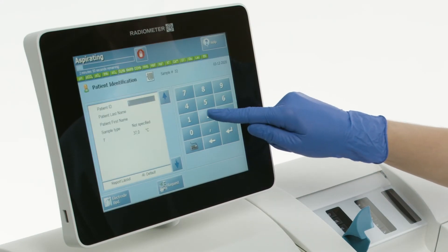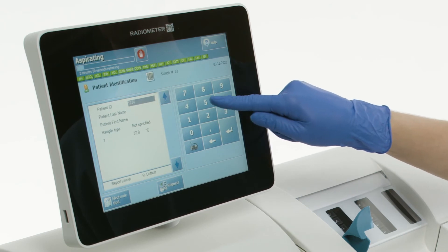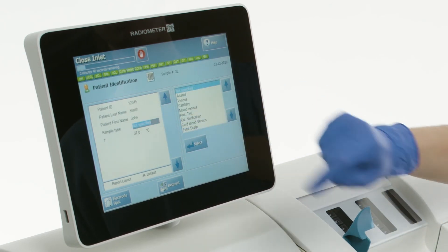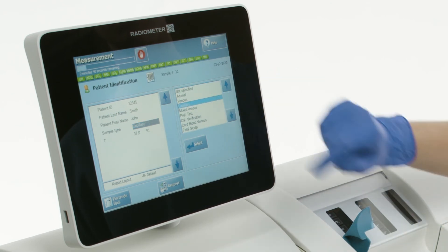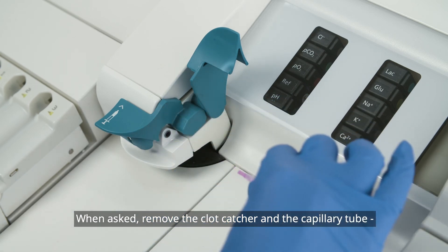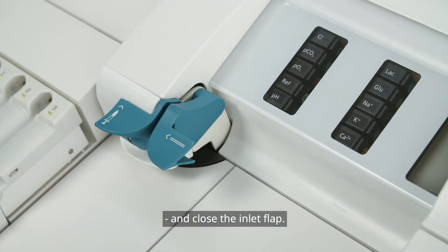Enter patient demographics. When asked, remove the clot catcher and the capillary tube and close the inlet flap.